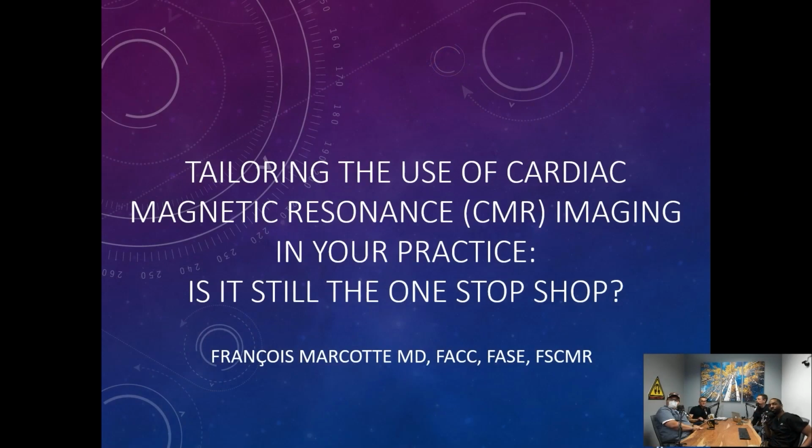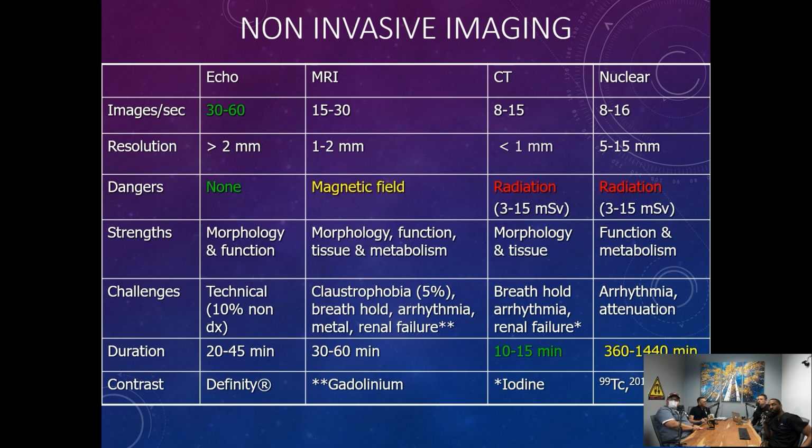Cardiologists who see patients with heart disease are faced with a fairly limited number of clinical problems. That's the nice thing about cardiology. They're short of breath, they have chest pain, palpitations, they pass out, or they have swelling. We have a number of tests, and typically as a first-line test we'll do a chest x-ray, EKG, and an echocardiogram. But one limitation we have with echo is what we call the spatial resolution, the ability to see small things.